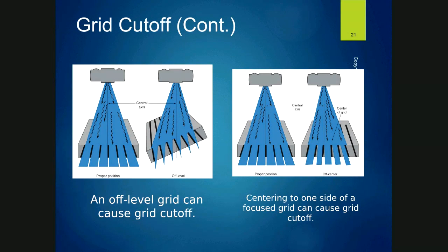All of that extra soft tissue tends to go with gravity and look nice and flat, whereas their spine can be twisted all kinds of ways. So you could have some scenarios like that, but probably not any x-rays or images that ask about grid cutoff, because that's just too much.